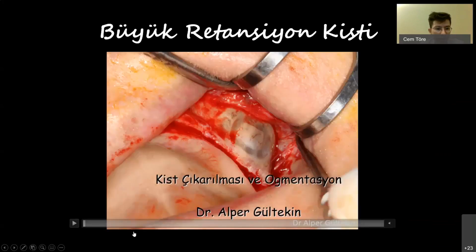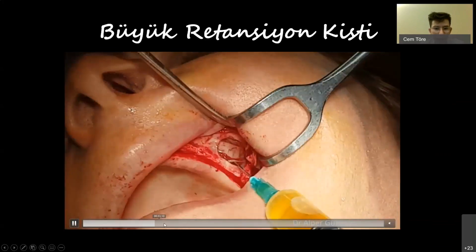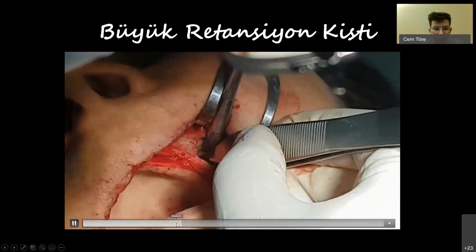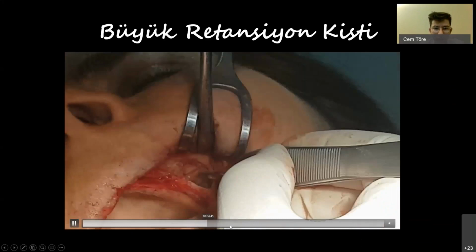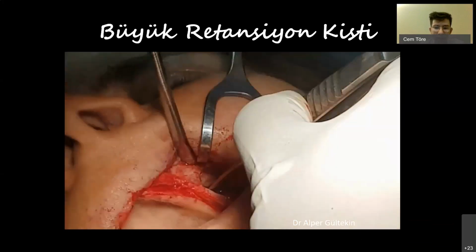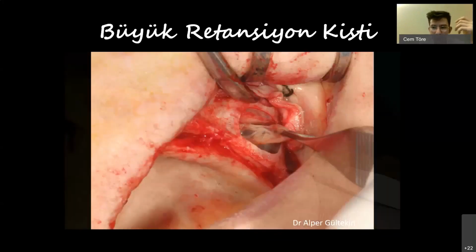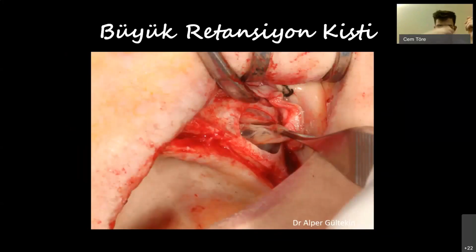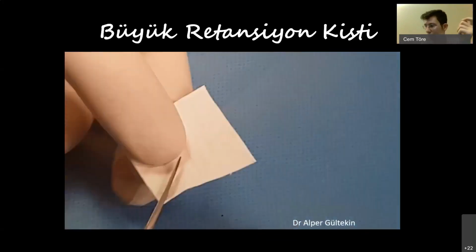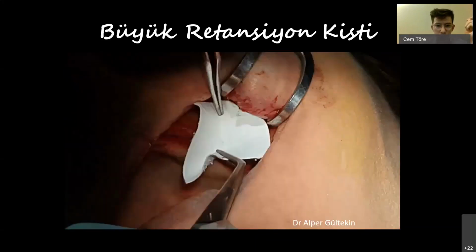Large retention cyst. We're doing this quickly. Aspirate the contents in an injector. We attempt to remove the cyst, but we can't remove it every time, nor do we need to. If you will enlarge the perforation to a whole new level and create a huge gap in the membrane, if you become stubborn and try to remove it all, you can just leave it inside. It will have no detrimental effect as long as its contents are sufficiently aspirated.